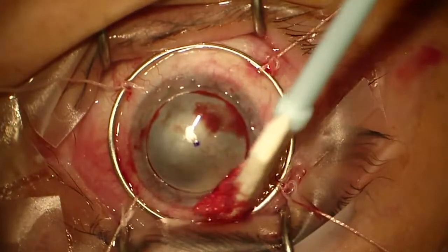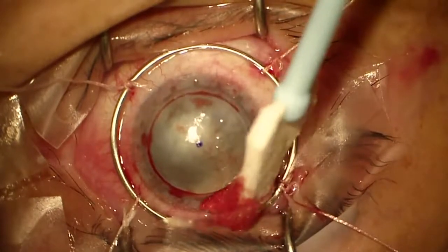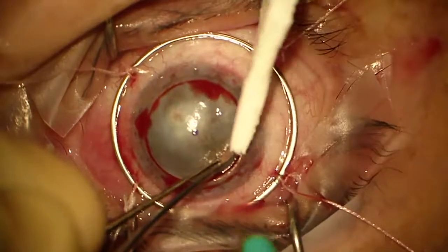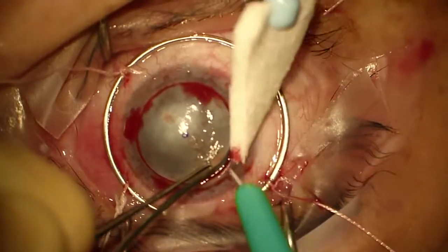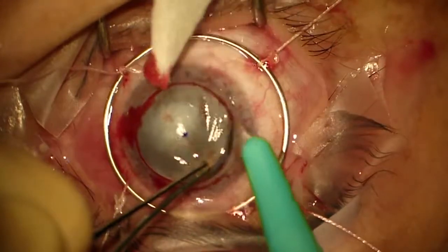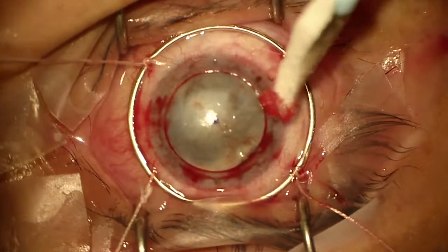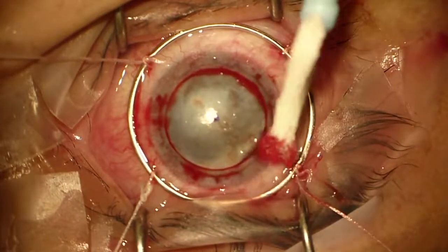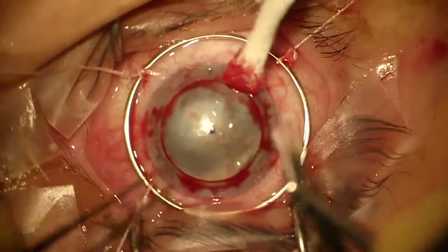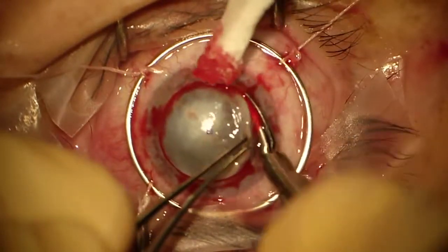One of the things you can use, we don't have it available today, is topical thrombin. The neurosurgeons use it all the time. 1,000 units per cc will stop this bleeding altogether. Sir, there's a question: if we use topical epinephrine, would it also work with the bleeding? It'll help a little bit. The problem with topical epinephrine is that, number one, it doesn't work as well, and number two, it can be problematic for the anesthesiologist. So we prefer not to use topical epinephrine.